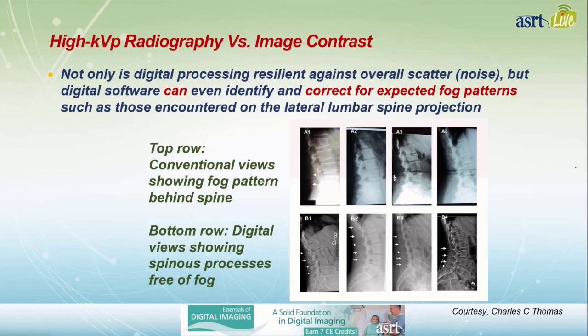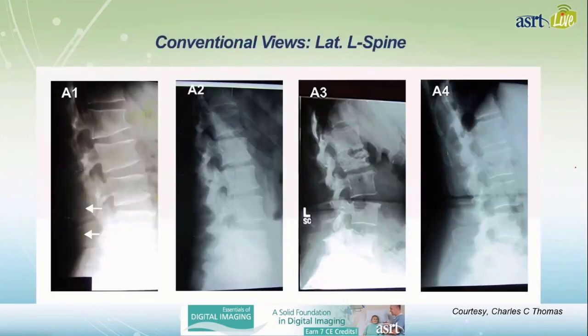So I just want to emphasize that. These next couple of slides, I'm going to skip through a little bit, just to make the point that not only can the computer clean up scatter in general, but they also have methods of identifying specific fog patterns and eliminating those.